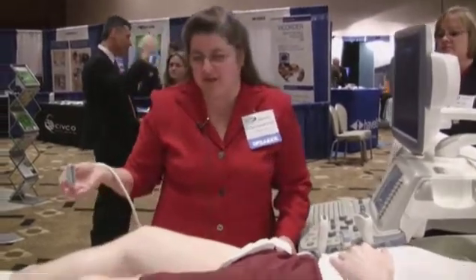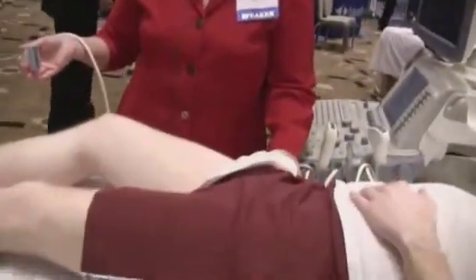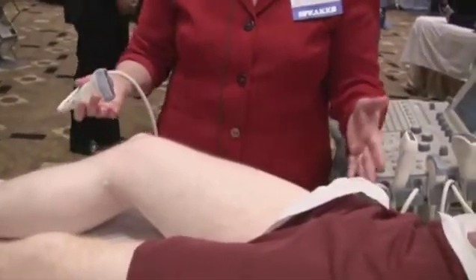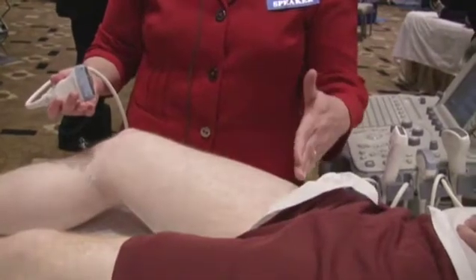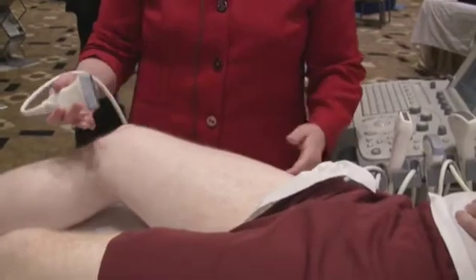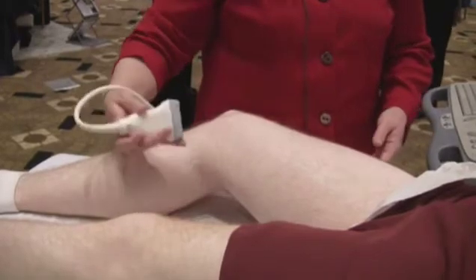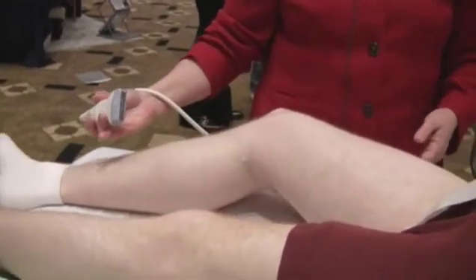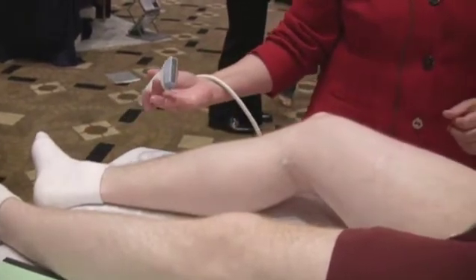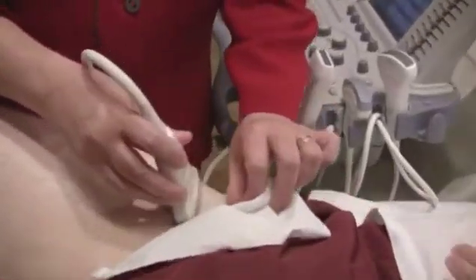As you can see from the patient, this is how we would like to have folks positioned, having their hip slightly externally rotated and their knee slightly flexed. From this orientation, we can pretty much see from the common femoral artery up here, down through most of the superficial femoral. Then we'll come behind, more posterior approach here to look at the popliteal, and then continue on down the calf, and we can pretty much see everything from this view. We'll just have to turn the leg when we go and evaluate the anterior tib. But we'll start up here at the groin and orient.